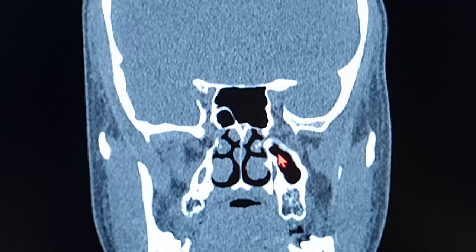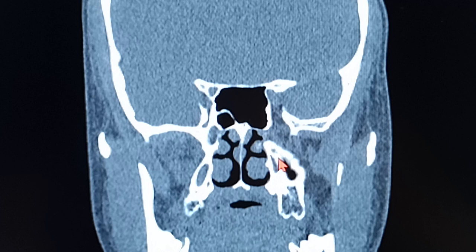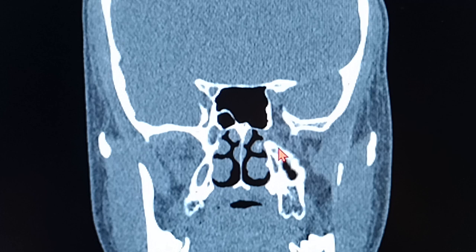You can see an opening. So as soon as the sinus ends, you can see behind that the pterygopalatine fossa, through which you can see an opening over here, right here. This opening is basically the sphenopalatine foramen through which the sphenopalatine artery exits. And I've shown you a video previously of exactly how you can lift the periosteum and see the artery running behind the posterior wall of the maxilla and coming out through the sphenopalatine foramen.